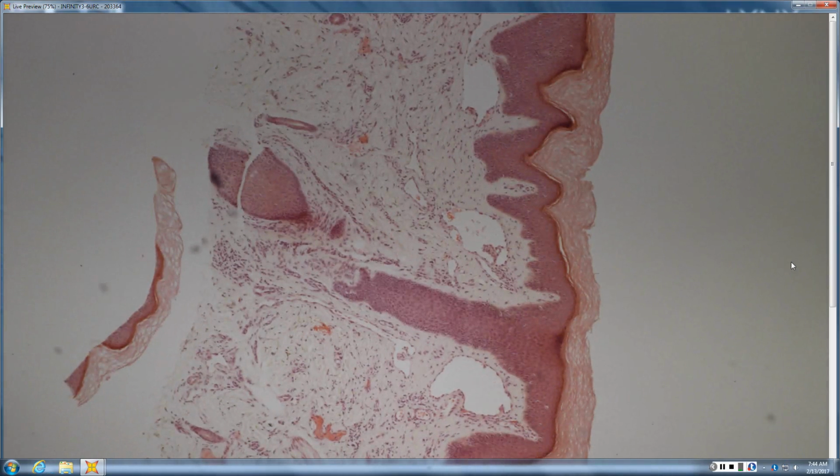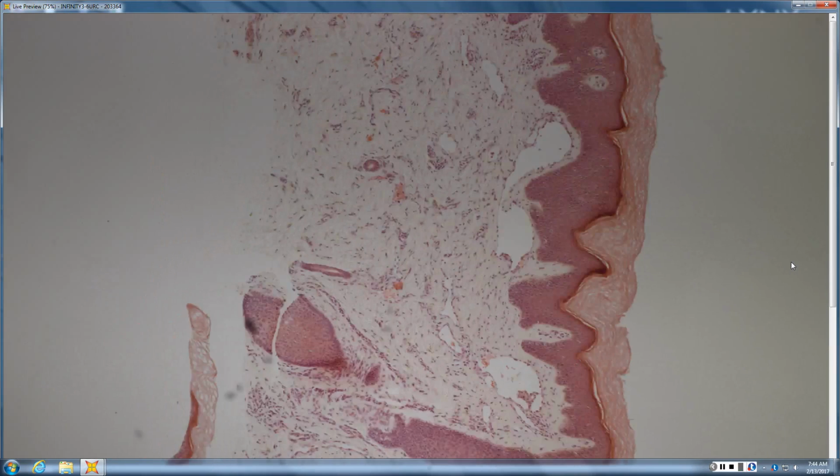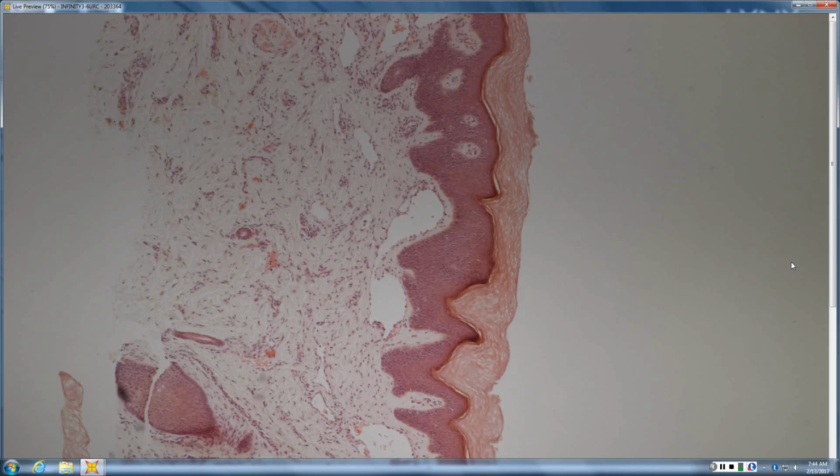Looks like an issue from the acral skin, or at least hyperkeratosis, if not. Agreed. Looks like there's a lot of cellularity in the dermis too, and maybe some ectatic vessels in the upper dermis. So very ectatic vessels up high, and they almost sit up in the papillae. Like some kind of angiokeratoma or fibroma. Yeah, it looks kind of like an angiokeratoma or a lymphangioma, depending whether there's heme or lymph there.